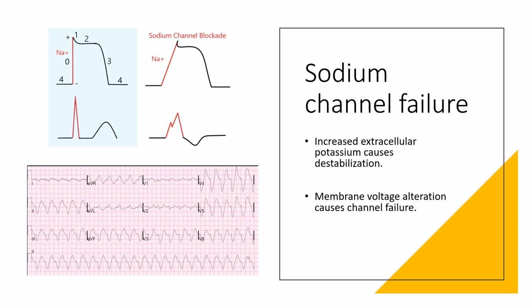But here's the key distinction. When you're dealing with hyperkalemia, if you have a wide QRS, especially if you see the QRS widen, knowing that it's not your patient's normal intrinsic ECG pattern, you have an unstable myocardium. The cell membrane is unstable. There are way too many potassiums outside the cell, which is not where potassium is supposed to be, and so your membrane voltage is messed up.